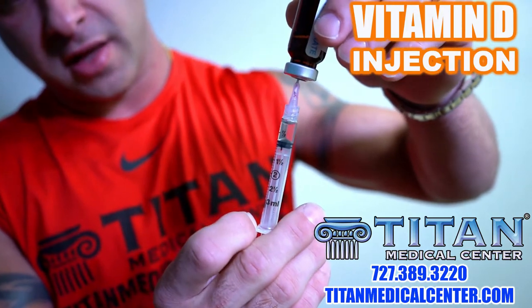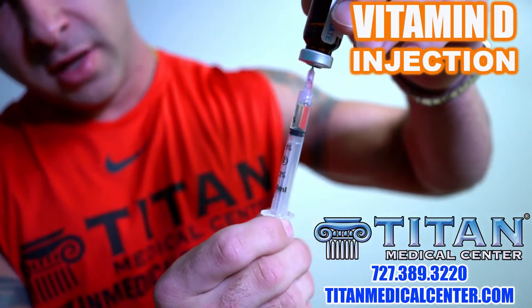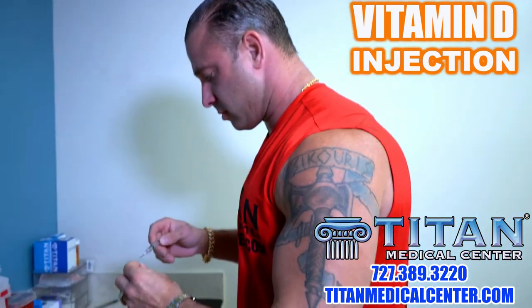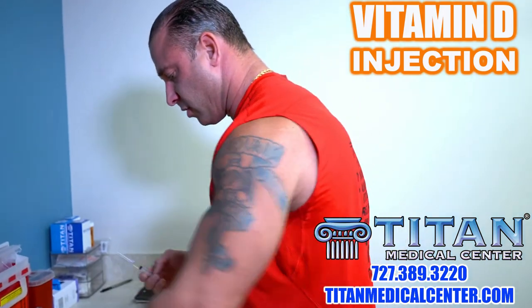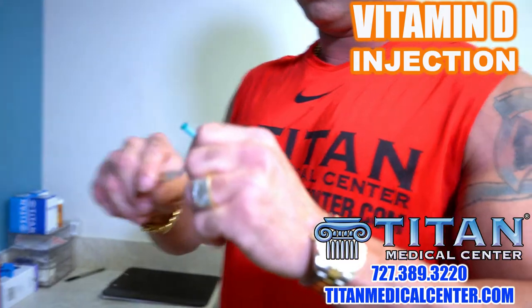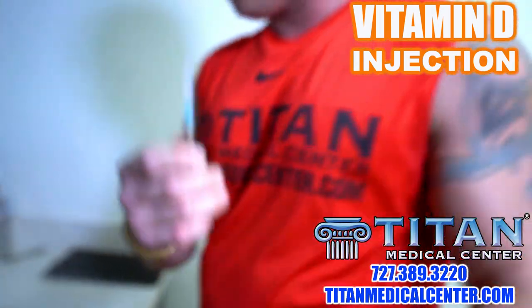You can see that oil filling up. With this bigger 18-gauge draw needle it's going to draw very easy — it's not going to be hard at all. Now we're just going to switch the tip, nice and tight. That's good.